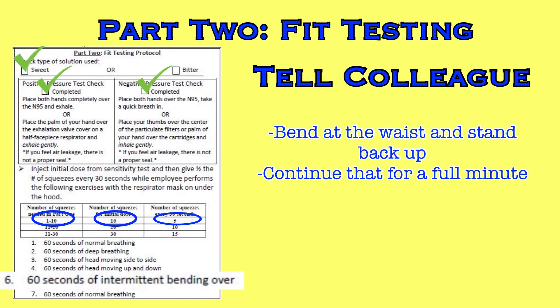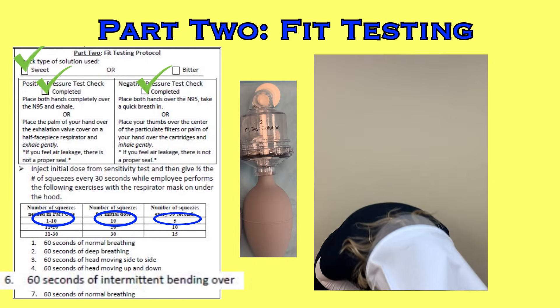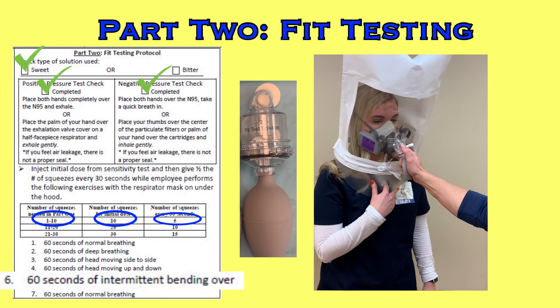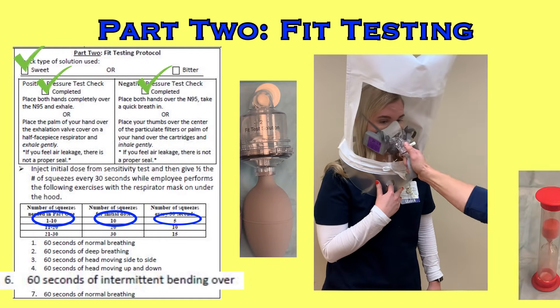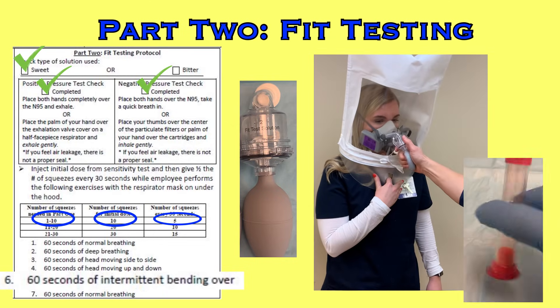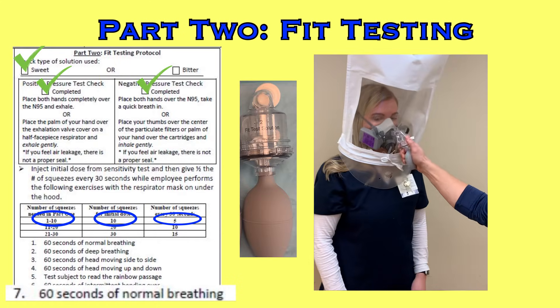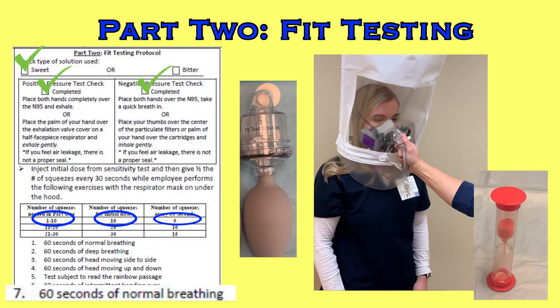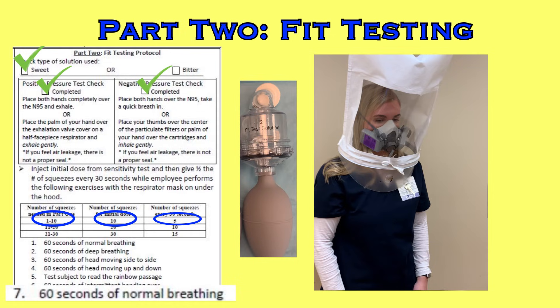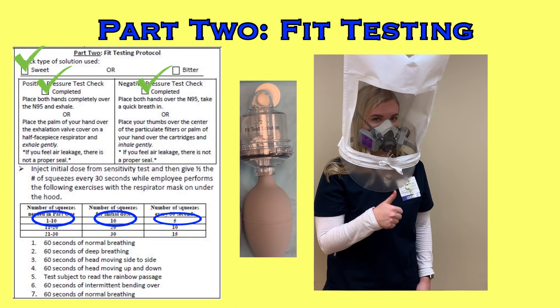'Now I need you to bend over at the waist and stand back up straight, and continue to do that for a full minute.' At 30 seconds, squeeze again and flip your timer. After the full minute, squeeze again, flip the timer, and tell them: 'For the last minute, you just need to breathe normally again.' After 30 seconds, squeeze again and flip the timer. After the full minute, if the colleague has not tasted the solution at all during the fit test, they have passed with that mask.